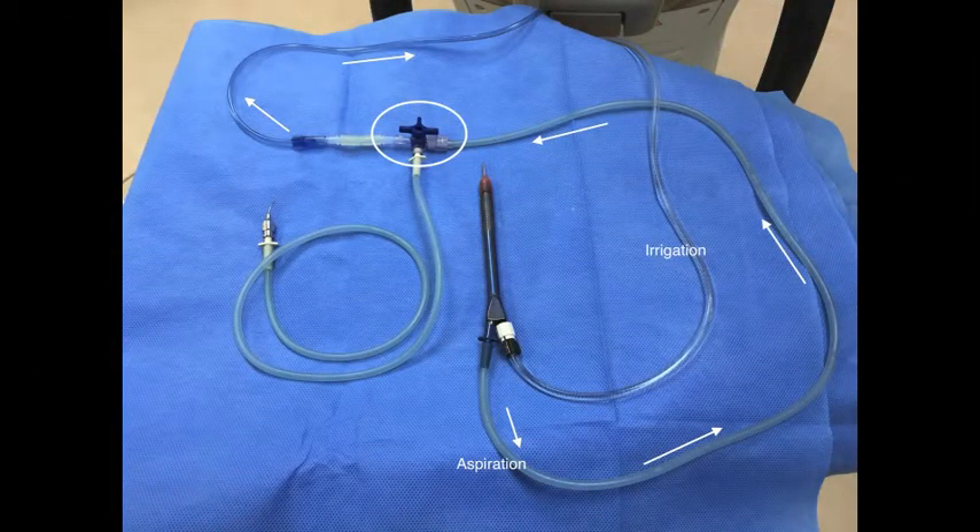As shown in this picture, the connection involves a standard tubing with a male-to-male connector and a three-way tap. With the three-way tap in this position, the aspiration is as indicated by the white arrows.